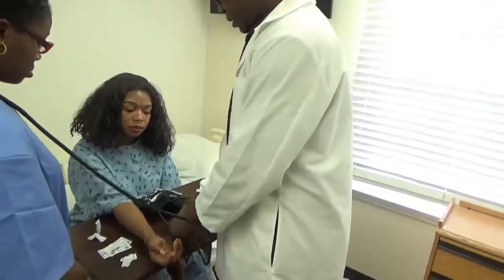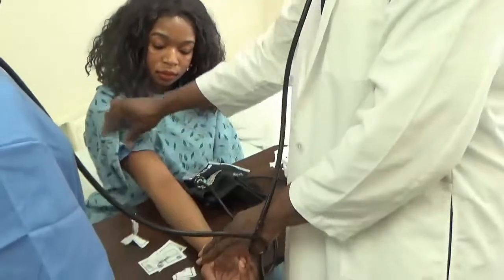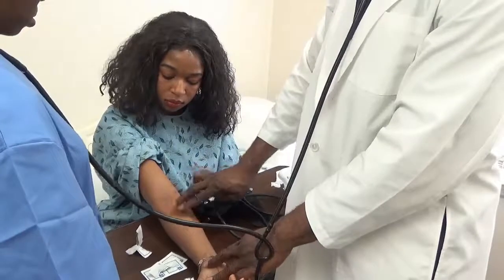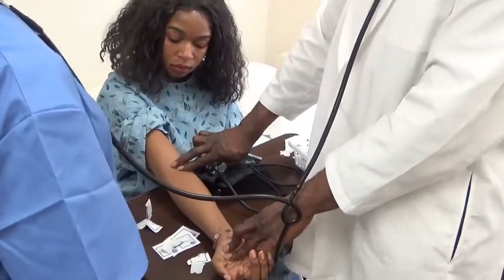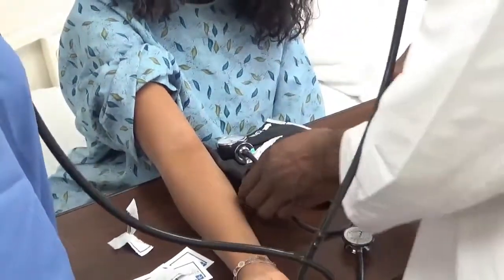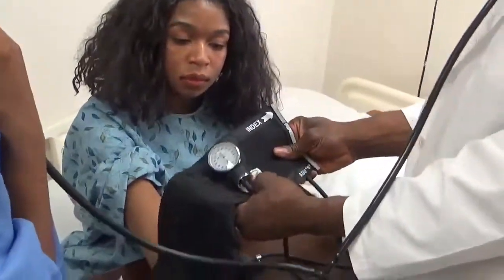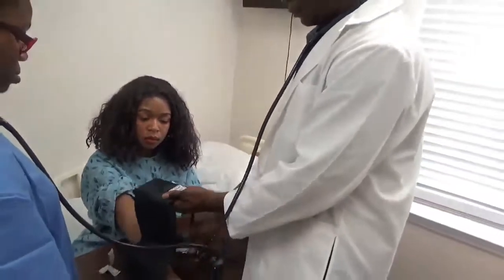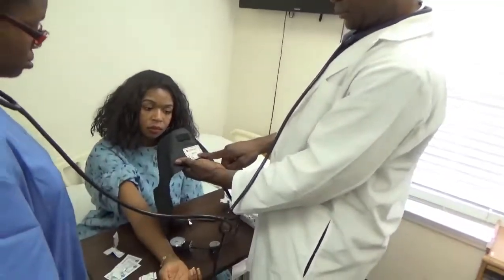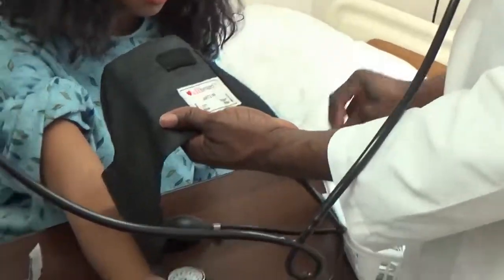Okay. Then, before you place the blood pressure cuff, make sure you locate the brachial artery. It's going to be in the middle there. Just go there and check it for about 2 seconds. Next thing is to wrap the blood pressure cuff. But before you wrap it, look at the information there. It says artery, left arm, artery, right arm. You just place your right arm on the table. Let me show.